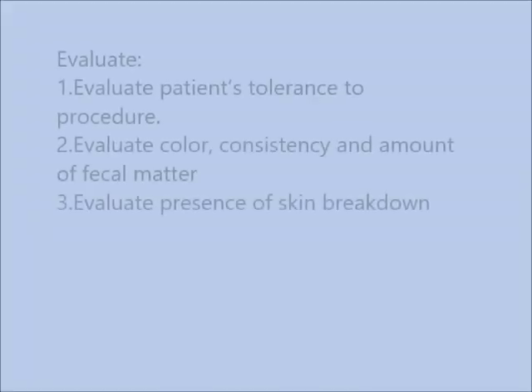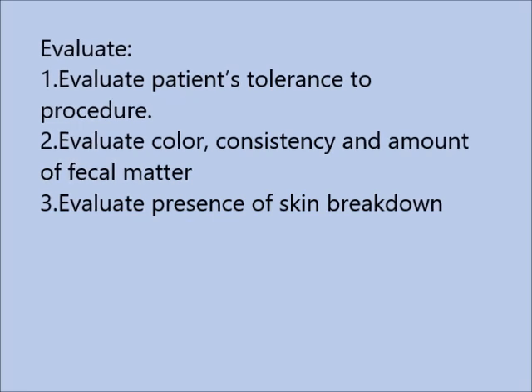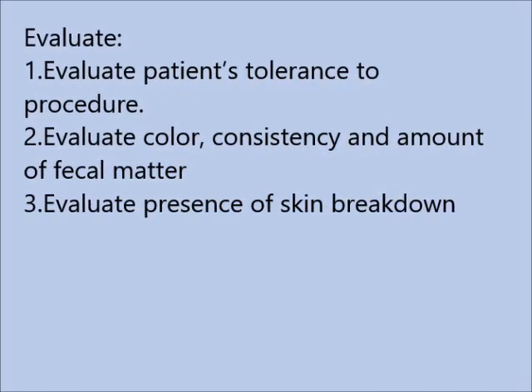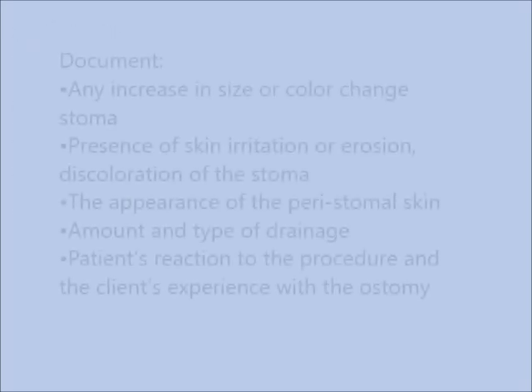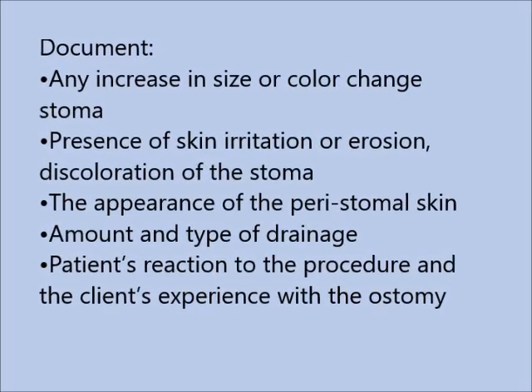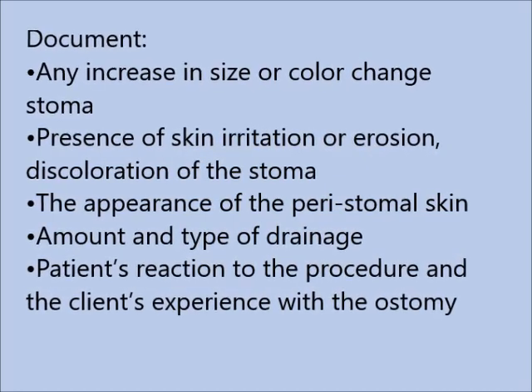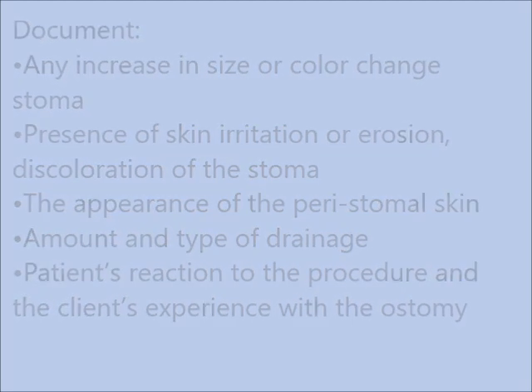After you've performed hand hygiene and cleansed all your equipment, evaluate the patient's tolerance to the procedure, the color, consistency, and amount of fecal matter, and evaluate the presence of skin breakdown around the stoma. Then document any increase in size or color change of the stoma, the presence of skin irritation or erosion or discoloration of the stoma, the appearance of the peristomal skin, the amount and type of drainage, and the patient's reaction to the procedure and the client's experience with the ostomy.